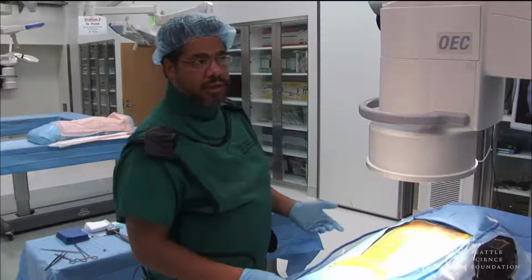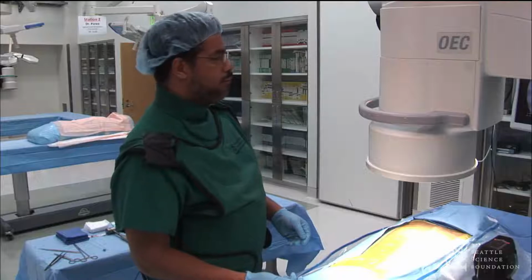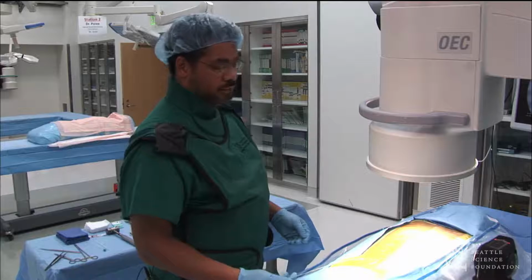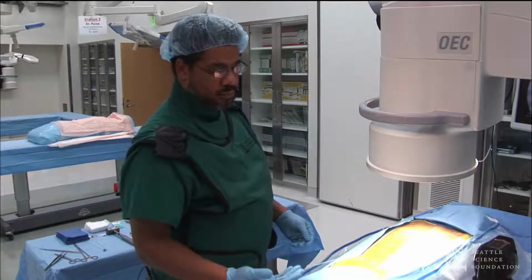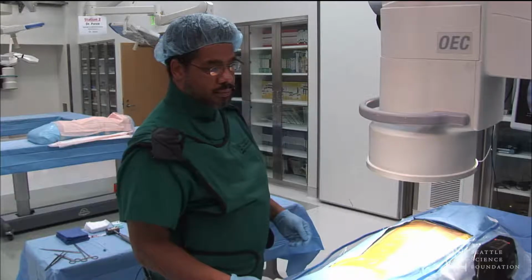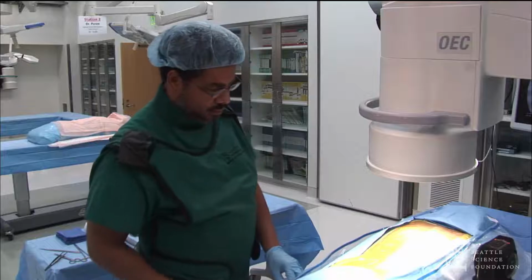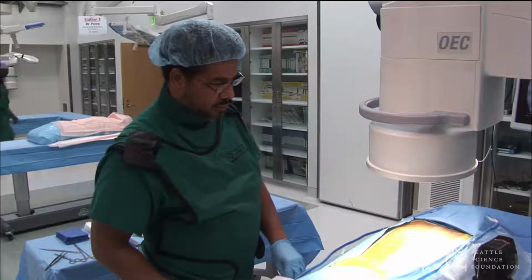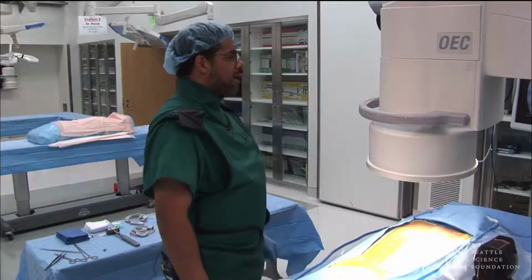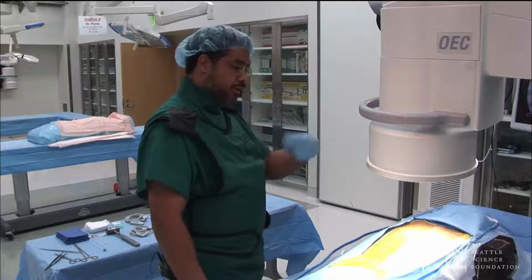And are there any particular questions at this point? Questions from the audience at all, right at this point? The question from the audience was if you're not checking very many laterals if you're midline. So if I haven't switched at all, I try to get into position, but then at this point, I would check a lateral.